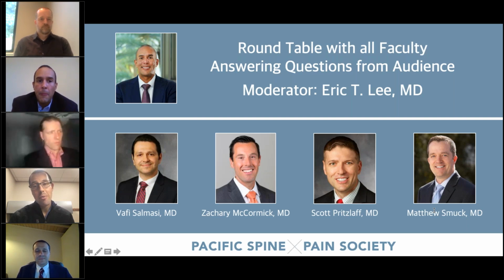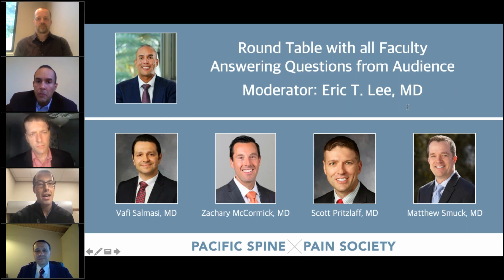Realistically, everywhere that I practiced, cooled RFA was available, and I practice in a large medical center. These are hospital-based outpatient procedures. So I'm, I guess, privileged that I don't have to worry about the cost of cooled. That's definitely a consideration. The cooled kit is substantially more expensive than a lot of the other novel technologies with dual-tined or 3-tined electrodes, and certainly more than conventional electrodes. So I essentially do use cooled for almost everything.